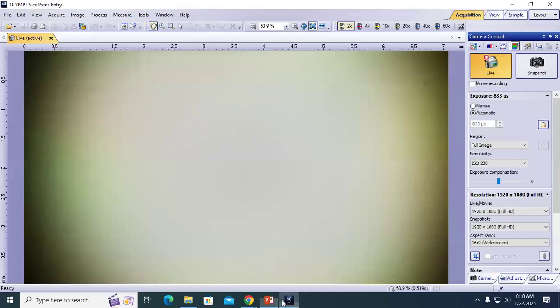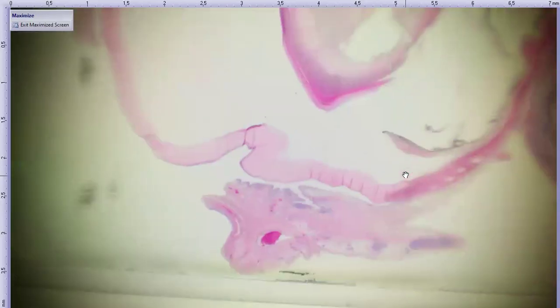If I switch us to the proper thing. All right. Okay, so here's our globe. The cornea is right there in this section. Also a few more cover slip scratches, probably from this morning's disaster. So here's the iris, here's the lens, here's the peripheral cornea, and it meets the sclera. You can see that tinctorial difference there where the sclera meets the cornea.